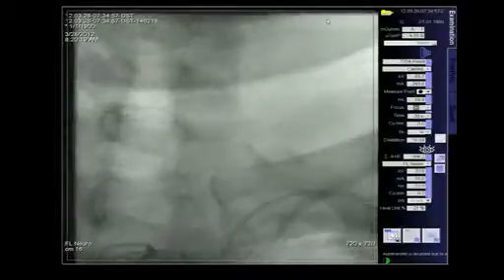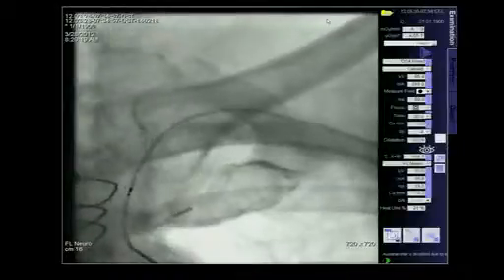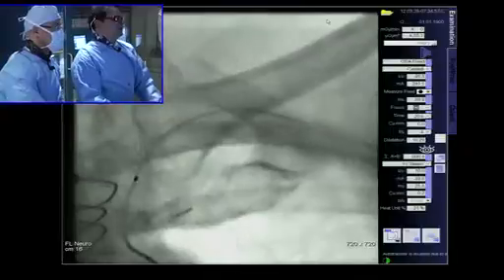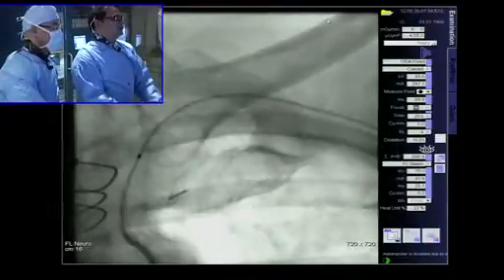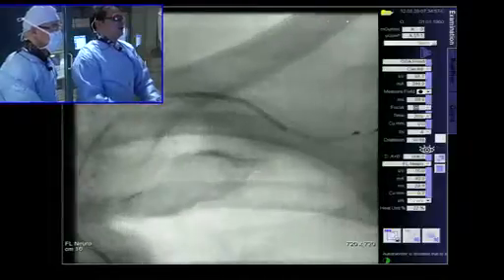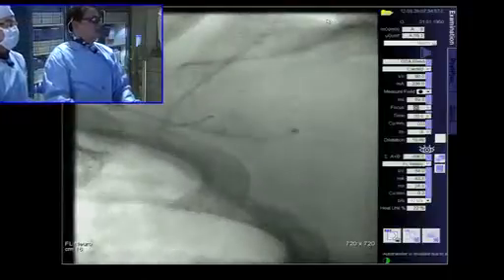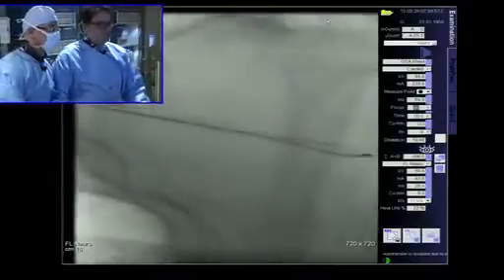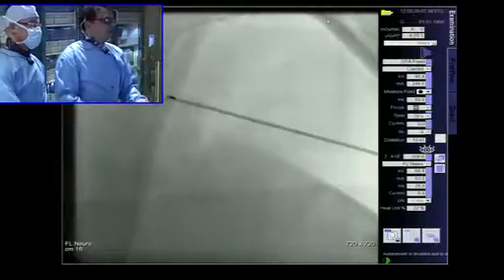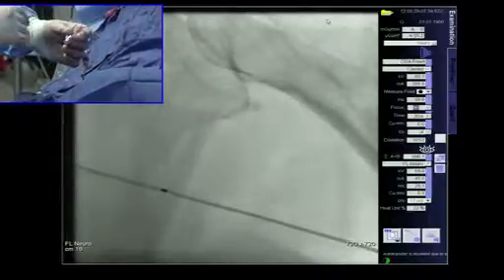Show me. So you can see here the soft part of the wire is out, so we're going to be very gentle in trying to get this through. I just want to get a little purchase with this catheter first. Once I get a little purchase with this catheter, maybe a little bit of twisting motion, a little bit of herky-jerky to get it through. Now I'm going to get this wire as distal as possible. So now I'm just going to advance this wire, and Dr. Wiley is going to follow the wire to where it's going to go. Show me a little lower. Even further. Can you twist the table, Ricky, so I can see the wire distally?